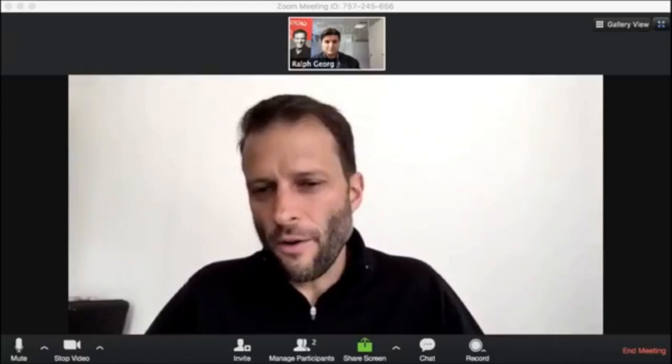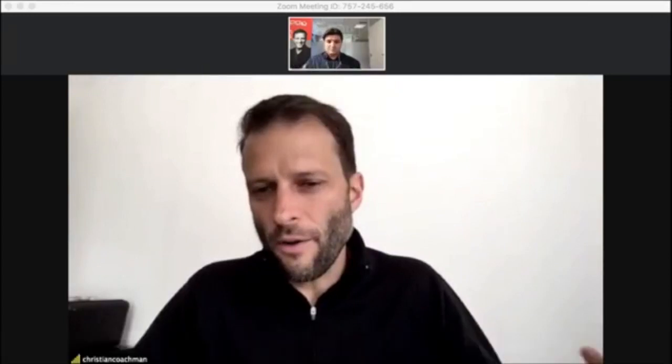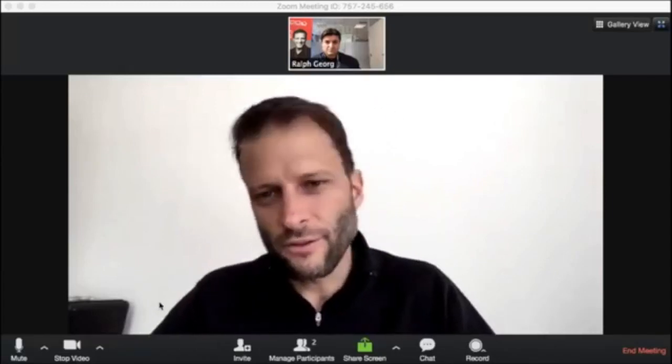And that's one of the keys of the planning center. It helps dentists to treatment plan better, to make better decisions for their patients. It starts from the smile simulation with the app, but it doesn't end there. We need to translate the 2D simulation into a 3D project. We need to link this 3D project with the bite. We need to list and analyze overbite, overjet, occlusion, vertical dimension. We need to analyze perio. We need to analyze structure and function.